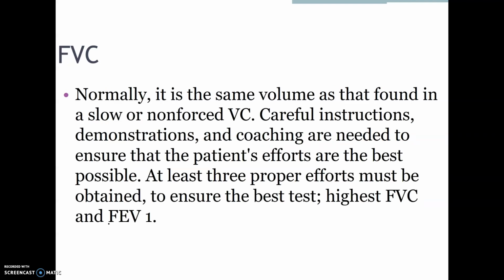Again, forced vital capacity will normally be the same volume as that found in a slow or non-forced vital capacity. You do have to give these patients careful instructions, demonstration, and coaching to ensure that the patient's efforts are the best possible. At least 3 proper efforts need to be obtained to assure that you get the best test.